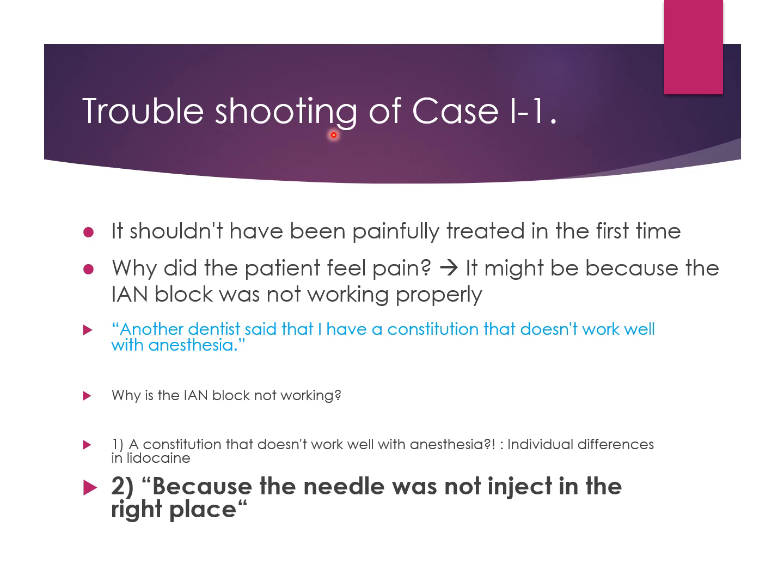Now, troubleshooting of the first case. It shouldn't have been painfully treated the first time. Why did the patient feel pain? It might be because the IAN block was not working properly. Another dentist said that I have a constitution that doesn't work well with anesthesia. Have you heard these stories from some patients?